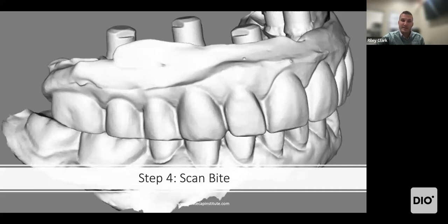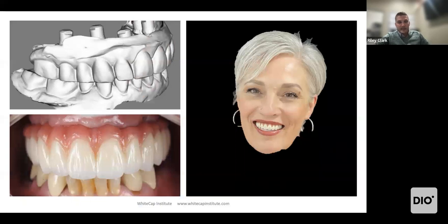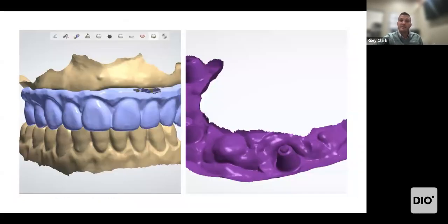Because if you think about it, they've been able now to record where the soft tissue is, where the multi-unit abutments are, where the teeth are. What's the proper bite? What's the shape of the teeth? They see all of that data. And so all you do after you've scanned the teeth like this is you'll take a patient, there's a video of me doing it. I'm going to skip that. You just send that data with a facial profile of the patient, teeth photo, and the lab takes all of that data and they can make whatever changes are needed to get you a better fitting set of teeth.